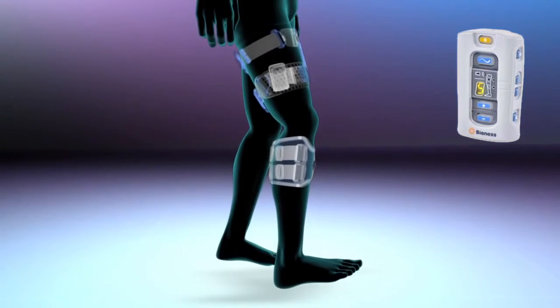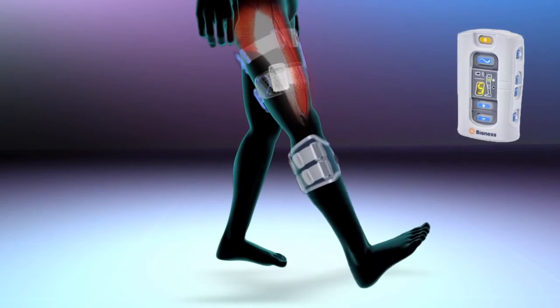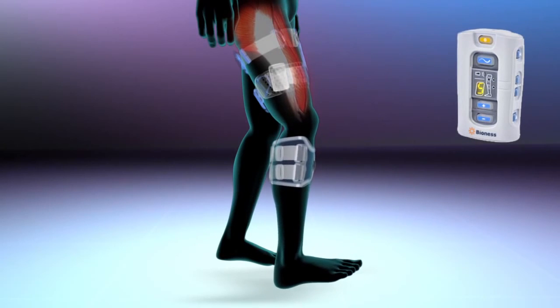The pulses from the thigh cuff activate the nerves, stimulating the quadriceps muscles that cause the knee to extend at the appropriate time during gait.